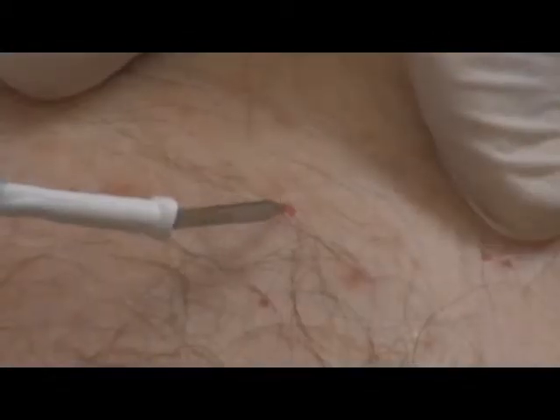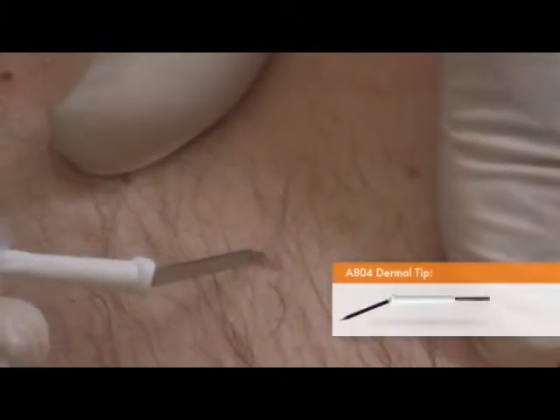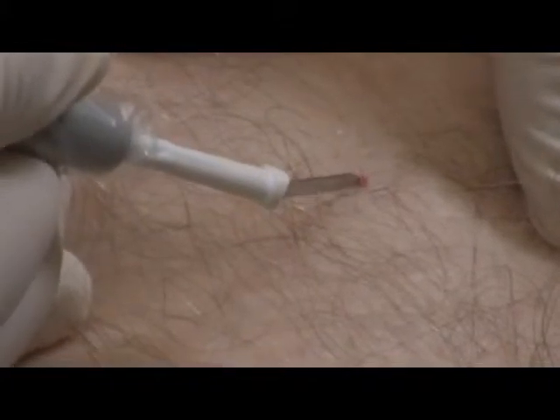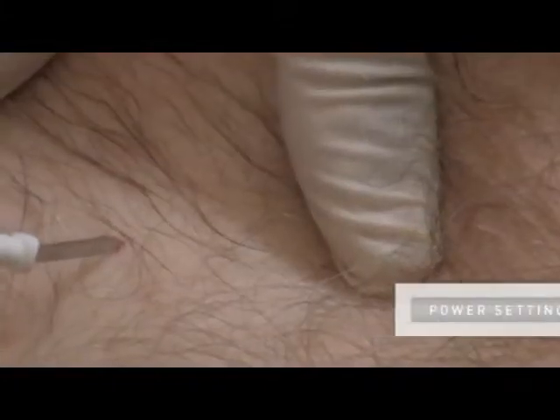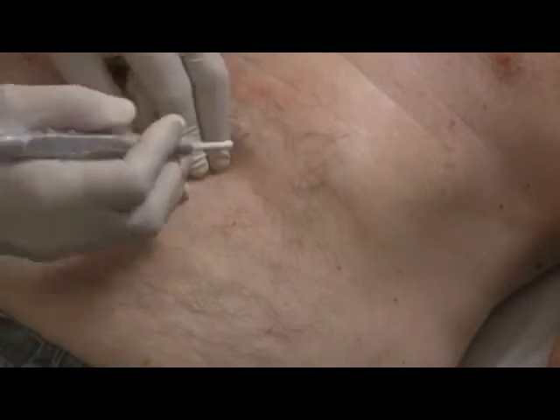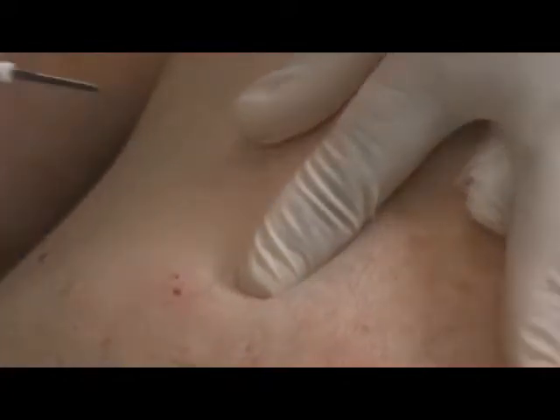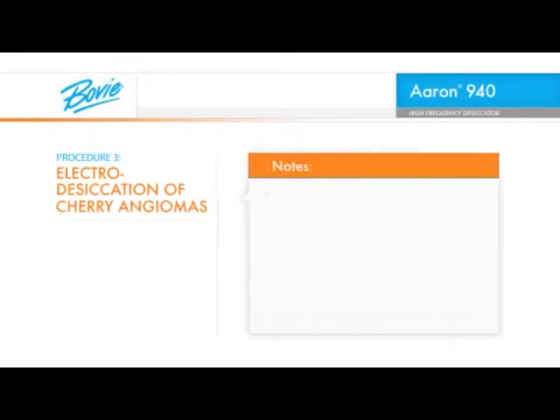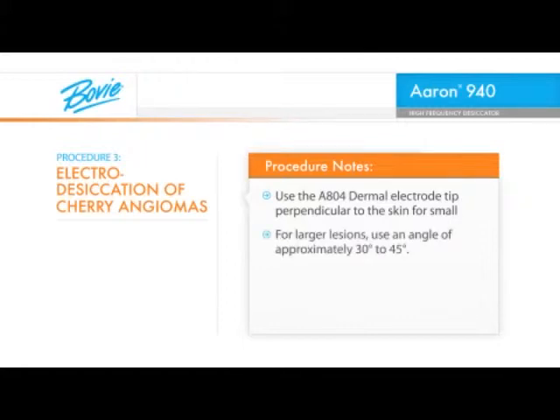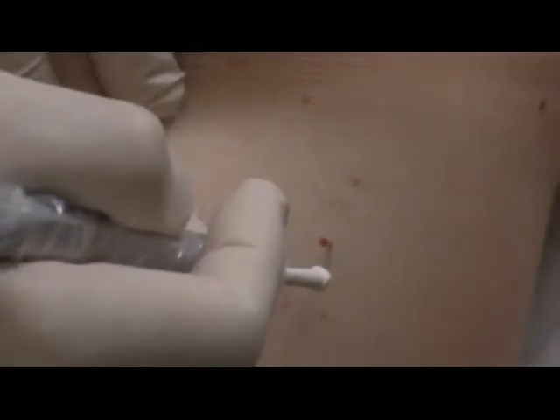For lesions larger than 2 mm, the ARIN 940 high-frequency desiccator with an A804 sharp dermal tip electrode is recommended. Always start with a low power setting and increase power as needed. For this type and size of lesion, a power setting of 2 watts is perfect. If at the post-operative evaluation the treated angiomas require additional electro-desiccation, use the same technique but reduce the power setting by 50%. Use the A804 dermal electrode tip perpendicular to the skin for small lesions. For larger lesions, use an angle of approximately 30 to 45 degrees. Observe how quickly we have eliminated the angiomas without the need of any anesthesia.